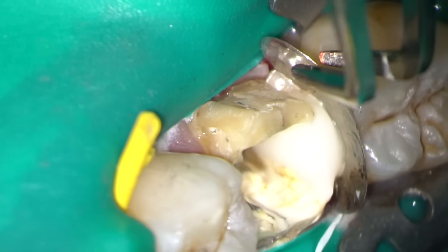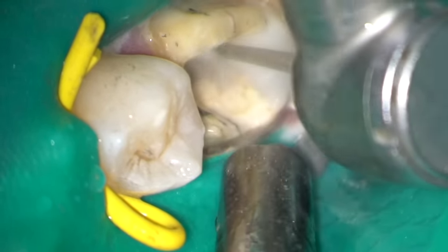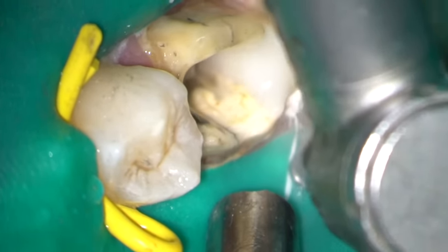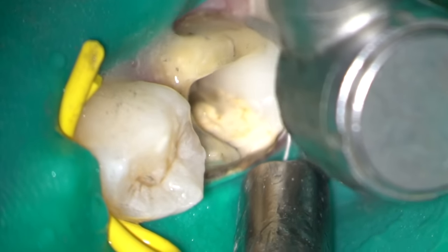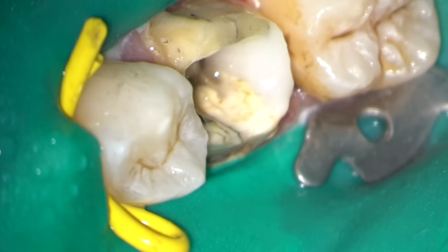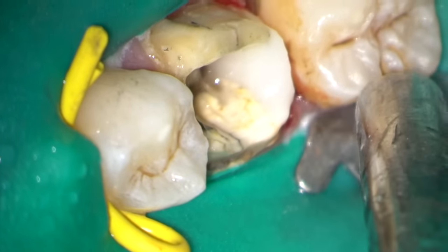A stainless steel matrix can be used, subgingivally held in place with PTFE tape. The cavity was then filled with dual cure composite. I'm now removing the PTFE tape and I'll remove the rubber dam to revert back to a single tooth isolation.